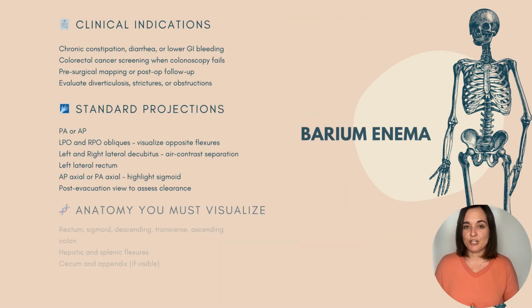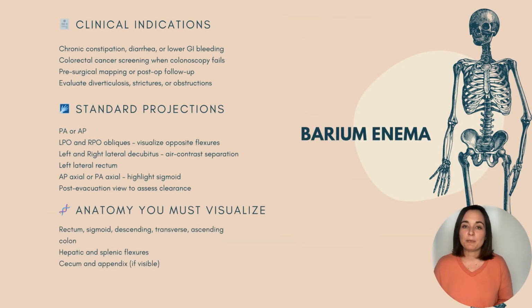Barium Enema procedure. The Barium Enema procedure may not be glamorous, but it's essential. It gives us a full survey of the large intestine, highlighting mucosal detail, shape, contour, and even early signs of disease. And yes, we still do them, especially when colonoscopy isn't tolerated or there's a post-surgical question.